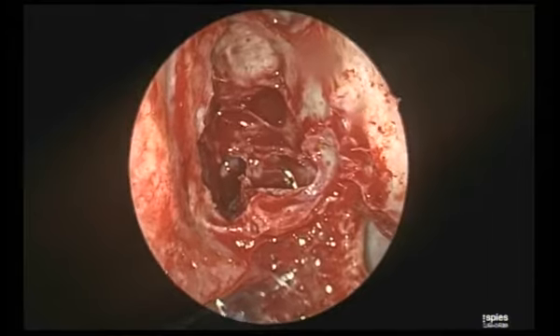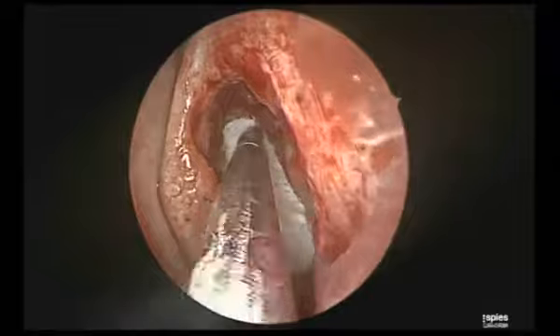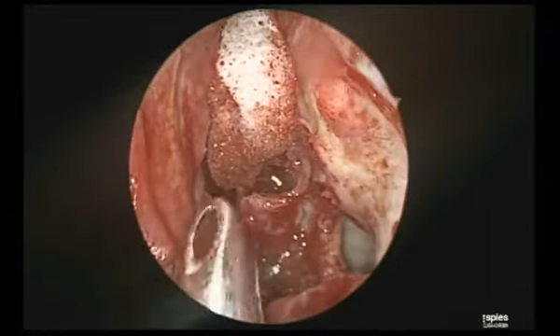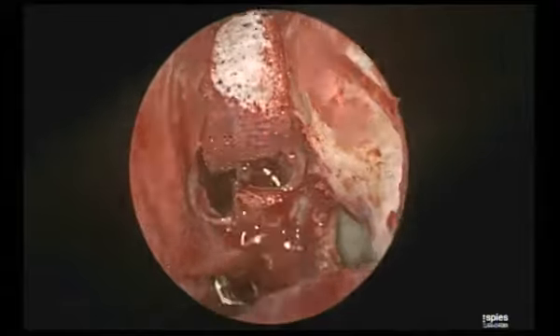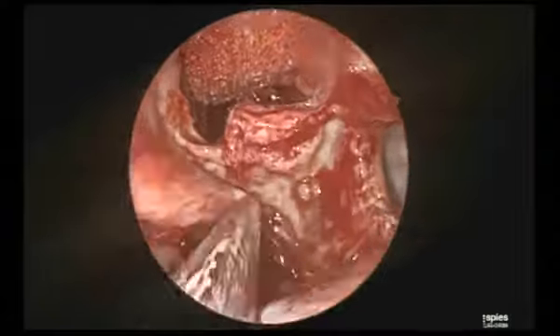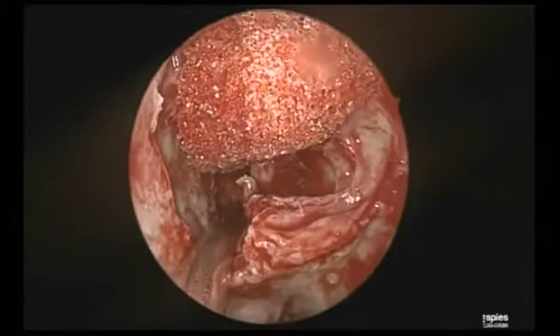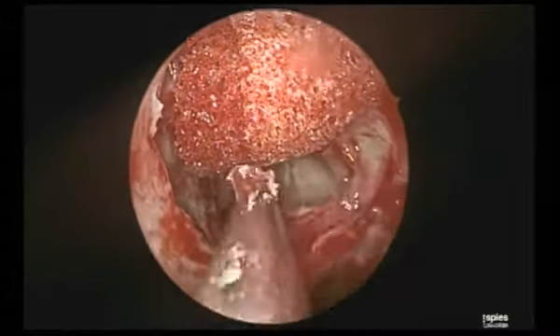See, it is the visualization that makes the difference. And it's a function of, besides of course the great surgeon that you are, also the equipment. This is the Karl Storz SPIES system that he's using. In both the theaters we have the SPIES. Arvind of course owns the HD Karl Storz, but we requested Karl Storz for the SPIES. SPIES is the number one camera, and the Medtronic micro-debrider. These two things are indispensable for me, and both companies are giving us the instrument support.